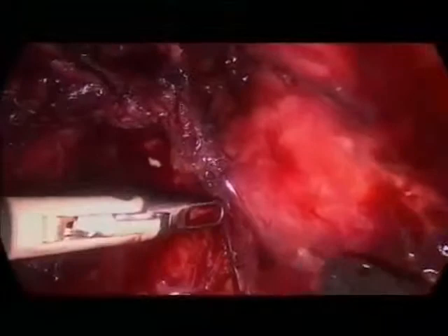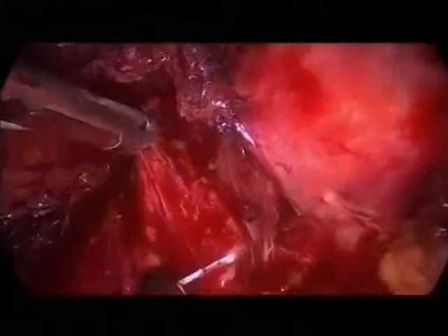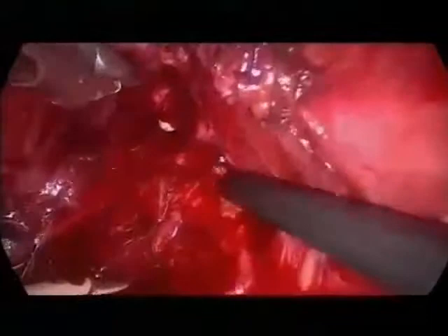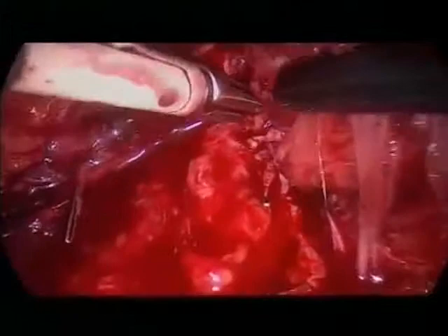Could you show us where you are? Is this the bladder neck exactly? You see the prostate. The puboprostatic ligaments. You see the urethra. I have cut the seminal vesicles. The prostate is completely dissected laterally. You see the Denonvilliers fascia, the bundles at this point, and now I am dissecting the bladder neck.